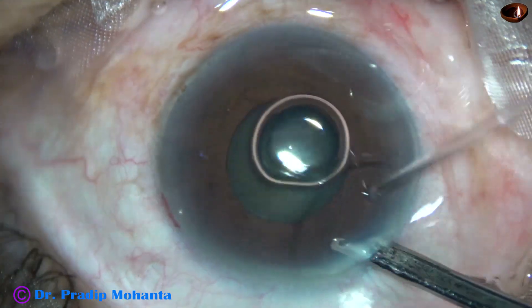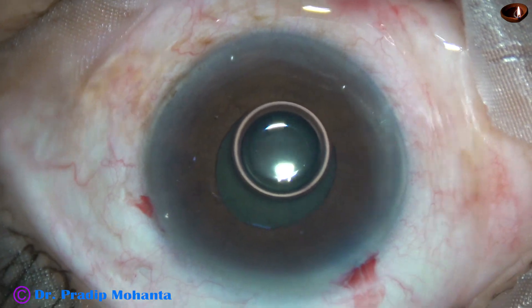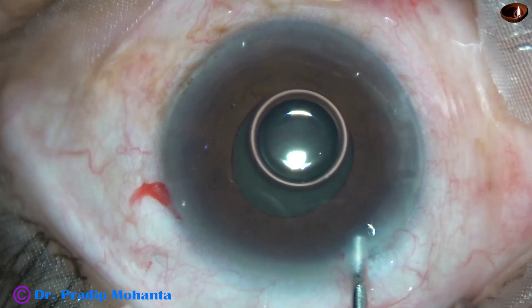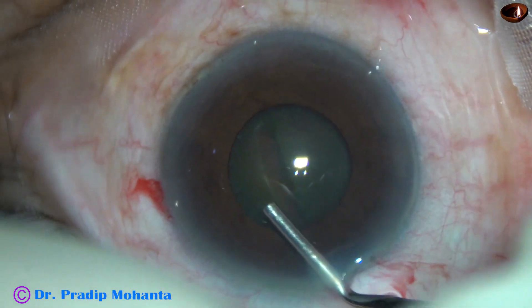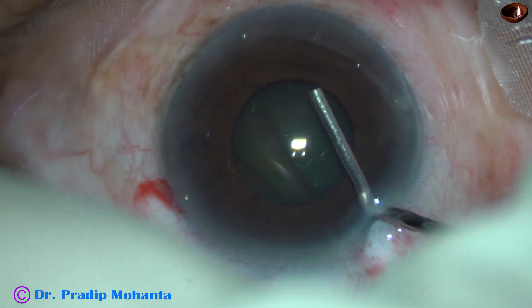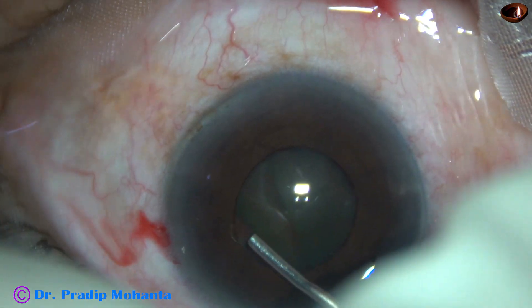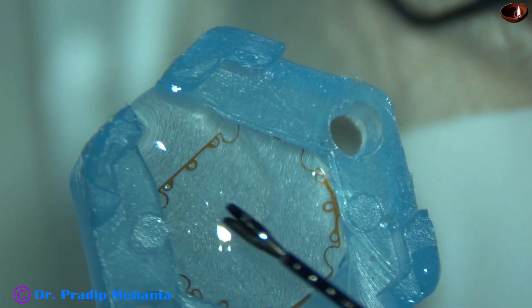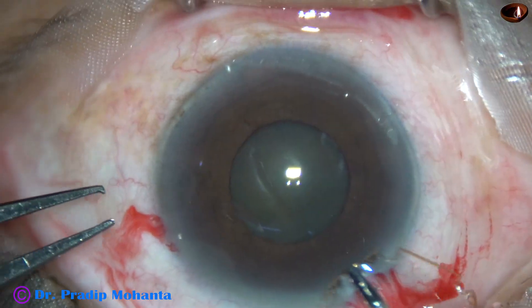You can see that the size of the pupil is about 3.5 mm, and I thought of using a pupil expansion device in this case. The pupil expansion device that I have with me is the B-hex pupil expander. B-hex is a hexagonal pupil expansion device invented by Dr. Suven Bhattacharji.